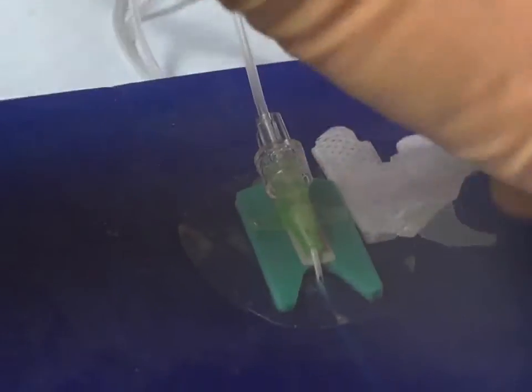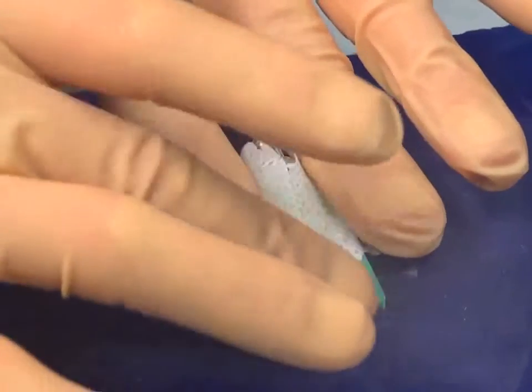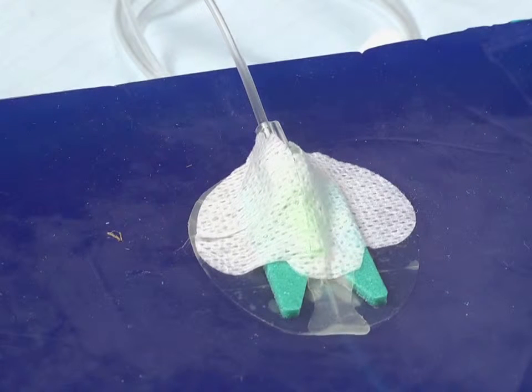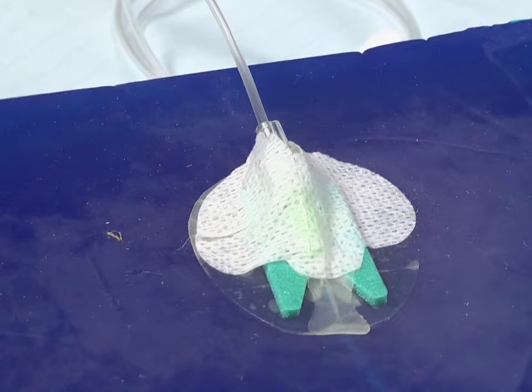Finally, remove the top covering paper and attach over the top of the fixer-cath, ensuring that the front patch covers the insertion point on the e-catheter. You may apply a Tegaderm dressing over the top.